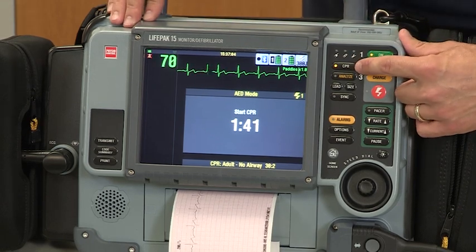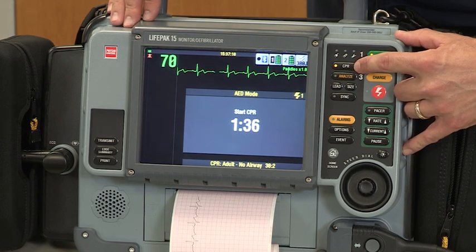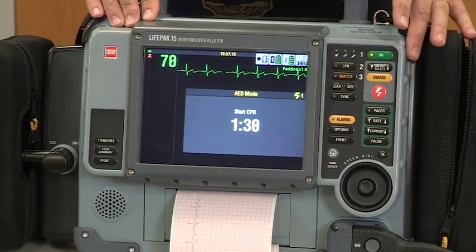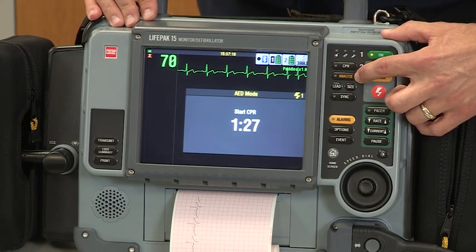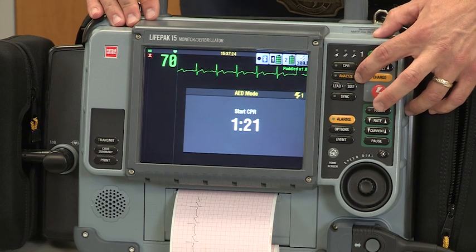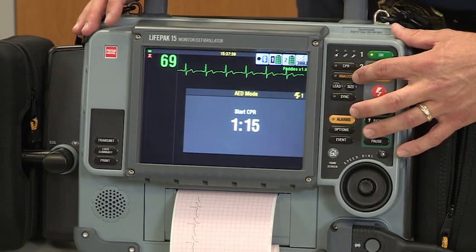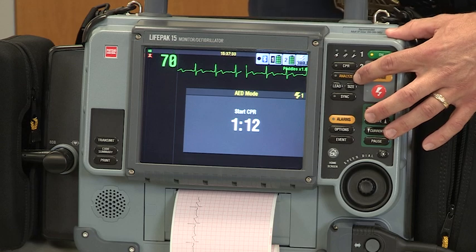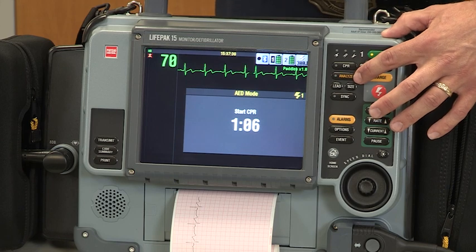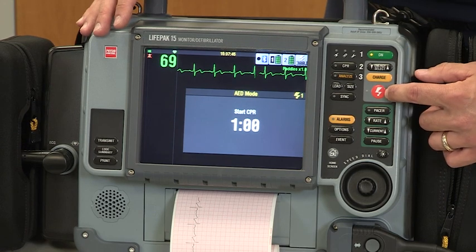Again, review: with the A.E.D mode on, the CPR metronome and the voice prompts for ventilation automatically come on. I'm going to go ahead and shut this off for just a second. One of the things I need to remind you about is that when you're in the analyze mode, you can't touch the patient. With the CPR protocol, it's imperative that we get at least 30 compressions on before we analyze the patient. Then it's going to give a shock advised or no shock advised. If a shock's advised, it's going to automatically charge, at which point we can continue with 30 compressions on the patient. Once we've completed 30 compressions, we can go ahead and deliver the shock.